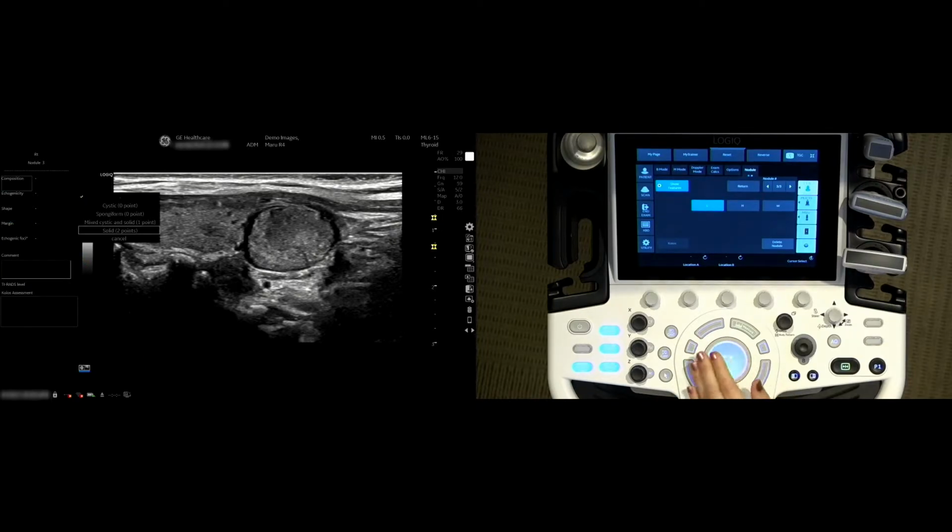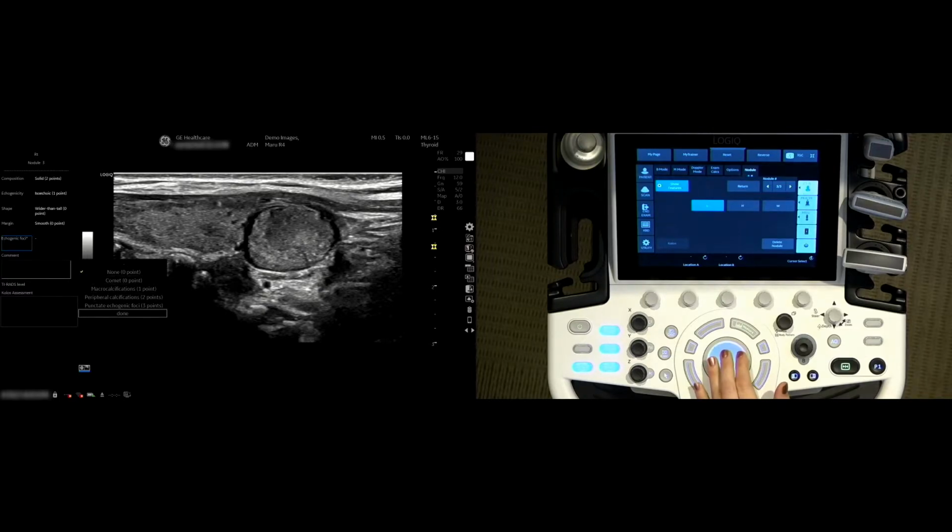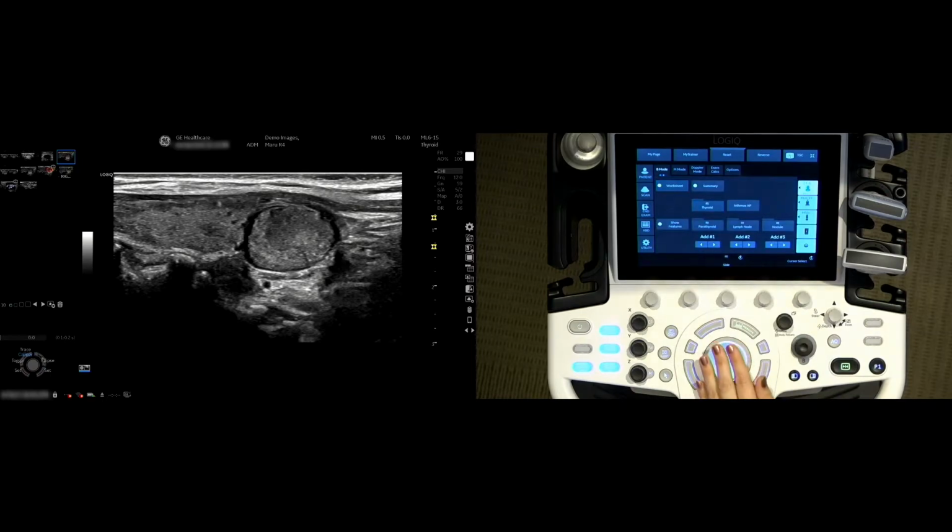So we can tell the system what the composition is, the echogenicity, the shape, the margin, and also if the nodule has any echogenic foci. The system will then produce a TIRAD score. We also will produce a worksheet summary, and this improves the diagnostic confidence for our clinicians.